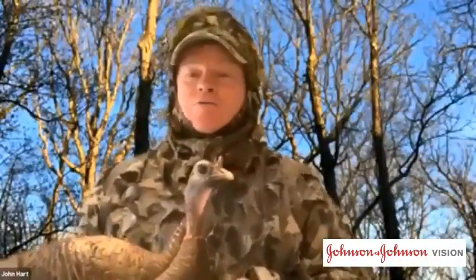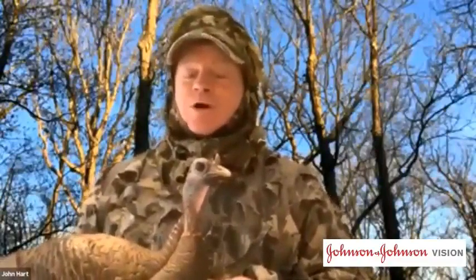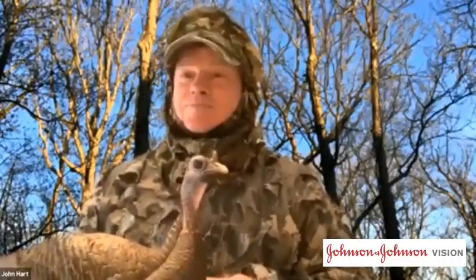Instead, I aim to uncover an occult cause of posterior capsular rupture caused by silicone IA tips. Enjoy.